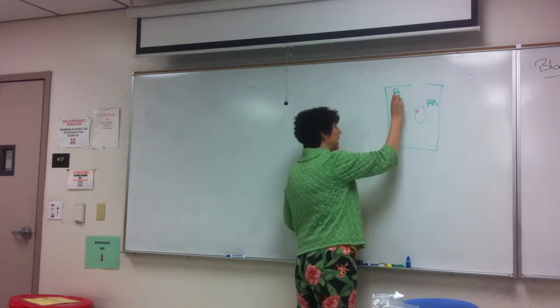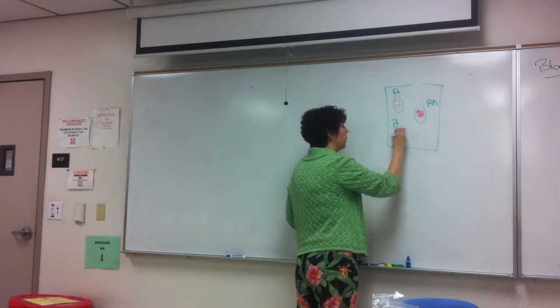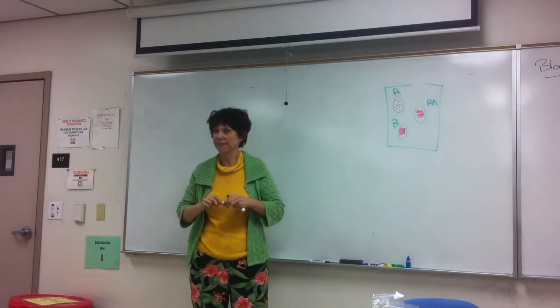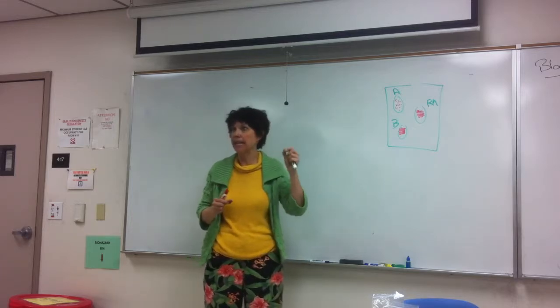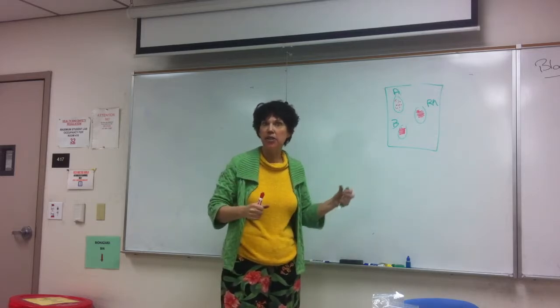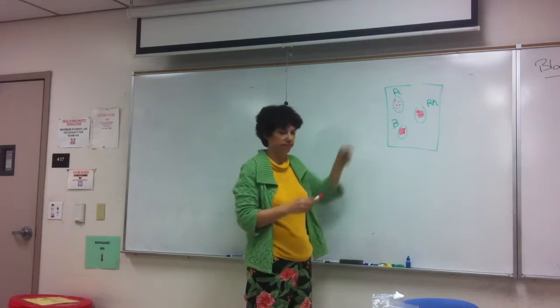So let's say it looks like this, and these 2 still flow pretty freely when you tilt it back and forth. They haven't thickened. So I have what antigens? Remember, I added antibodies, and if there's an agglutination, that antigen is present. So I have A antigen.